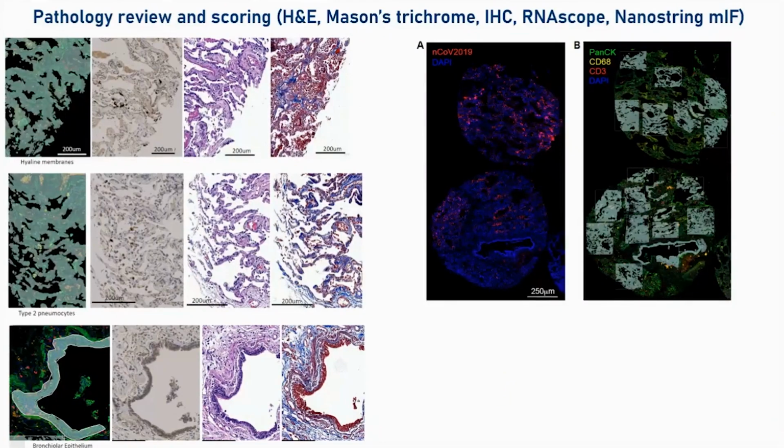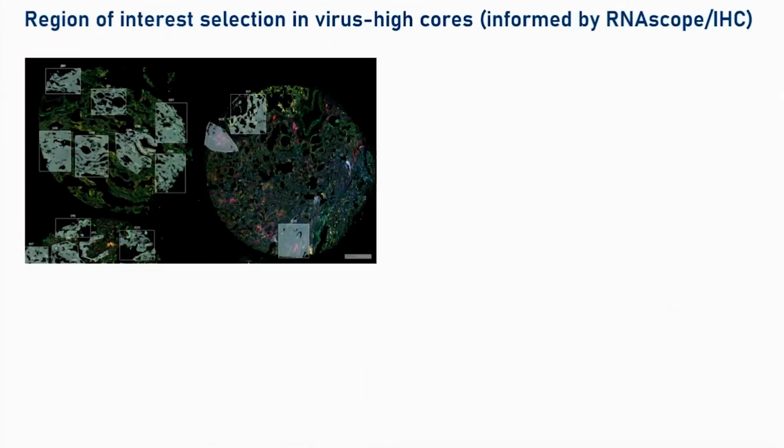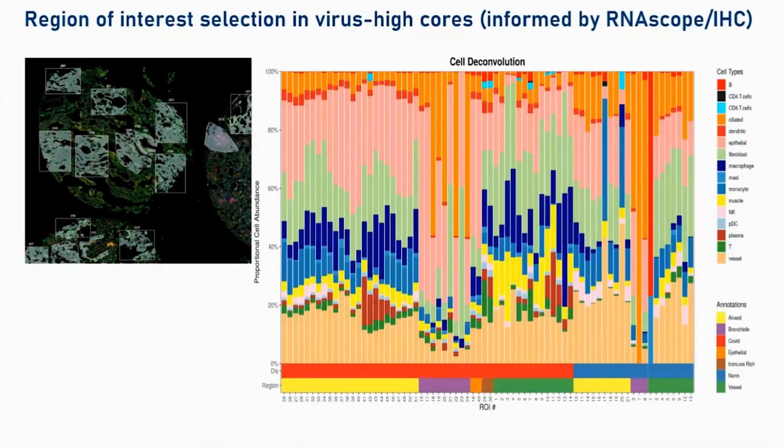So under the guidance of a pathologist, we could identify the hyaline membranes, the type 2 pneumocytes, the bronchoepithelial cells, and so on. And the beauty of the approach is that you can gate on these structures, such as the bronchoepithelial cells, or we could use the majority cell types within those regions of interest to profile. And so we could overlay the RNAscope data with the multiplex IF data, and then liberate the transcript data, and then interrogate the different cell types and what they look like. So this is what it looked like under the microscope.